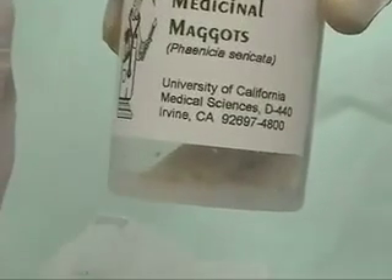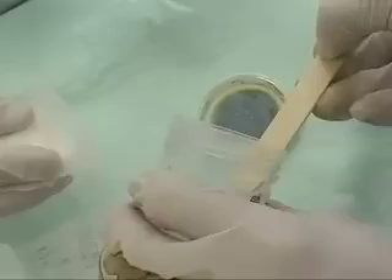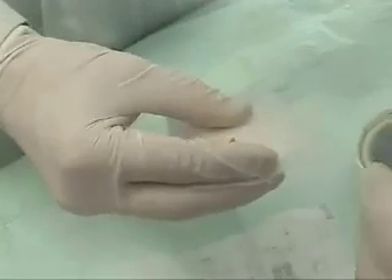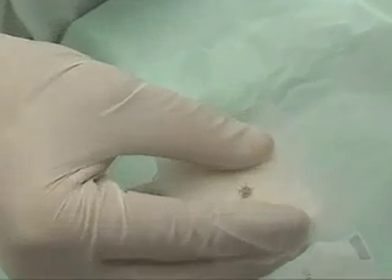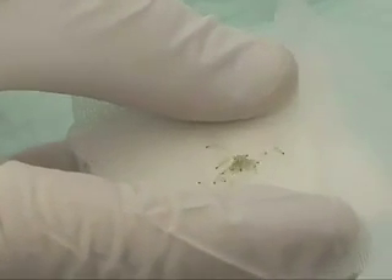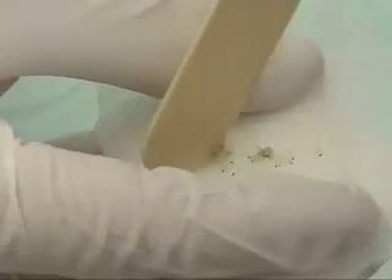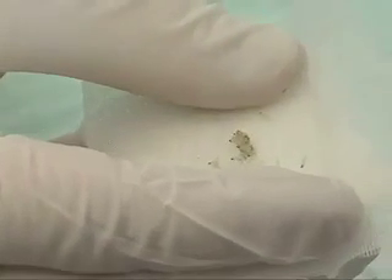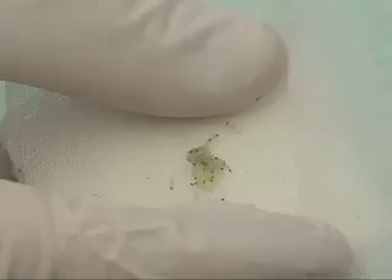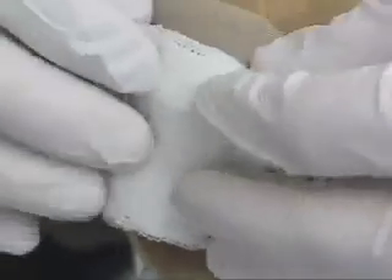The maggots come shipped in a sterile vial. They can then be coaxed out of that vial. We typically will use a tongue depressor. It's very important to put them into the center of your chiffon dressing because they do tend to migrate out rather quickly. So time is of the essence at this point. You then take that entire chiffon and dressing construct and apply it directly to the wound as rapidly as possible.